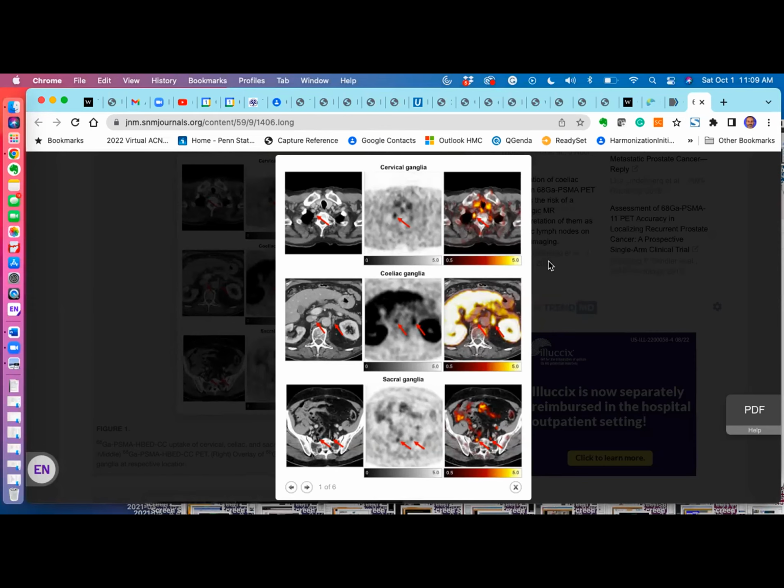Presacral, more likely we would see usually presacral mets with, say, colorectal. Now, we also felt, I think in the earlier days, that presacral would be very common with prostate, and they are sometimes, but then those ganglia really throw a monkey wrench in our smoothly spinning wheel, because I don't think we're that great at differentiating false positives from true positives.